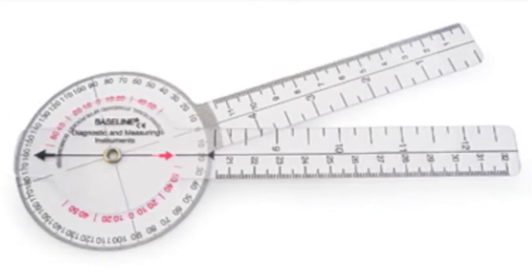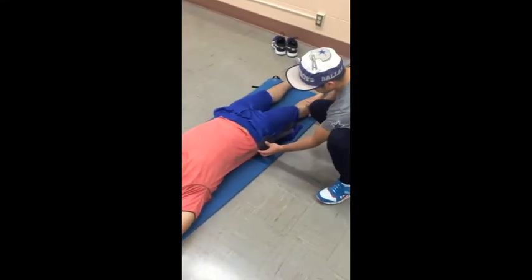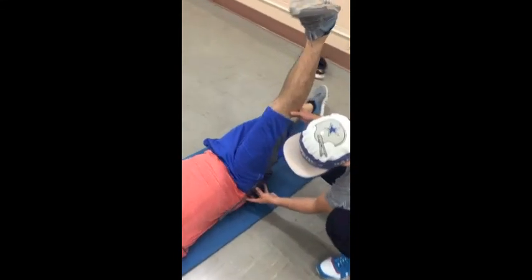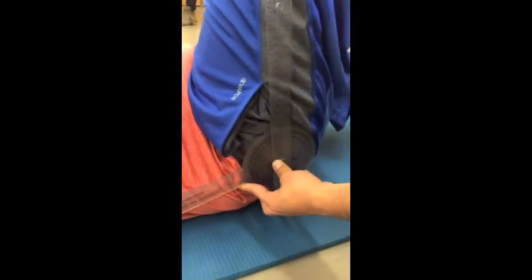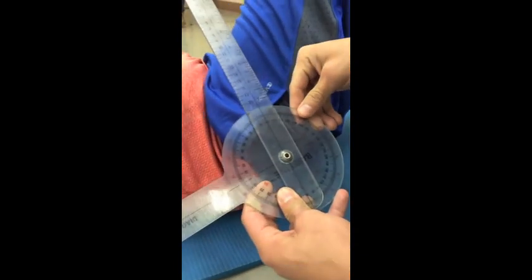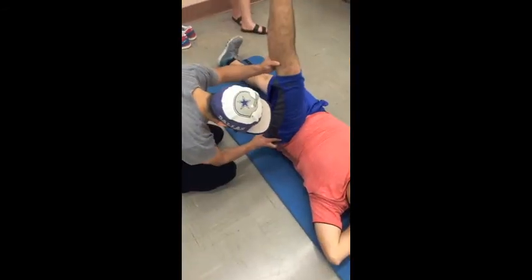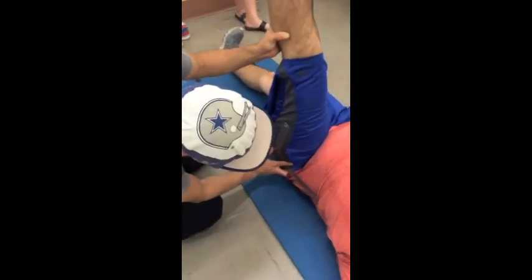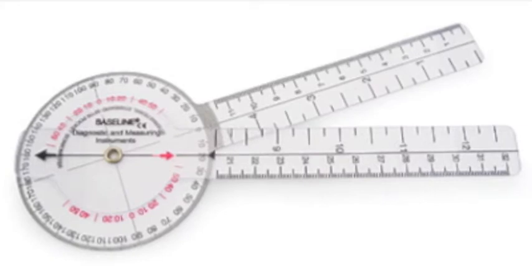You want to make sure that they lie in a supine position on their back with no arch on their back at all. You want to make sure it is flat against the surface. So one thing you want to do is place the axis of the goniometer at the greater trochanter of the femur. Now, you want to make sure you have your tester stretch the hamstring as far as they can go and test it on both sides. Keep in mind, since we're using a goniometer, it's going to be recorded in degrees. Anything below 80 degrees is bad. 80 is going to be acceptable, but 90 degrees is desirable.